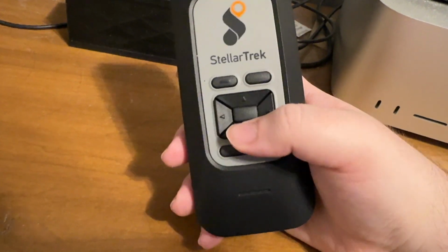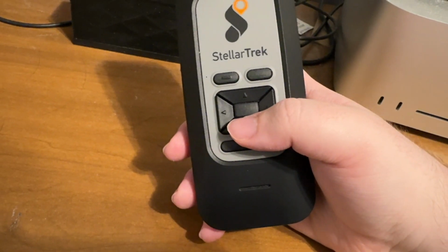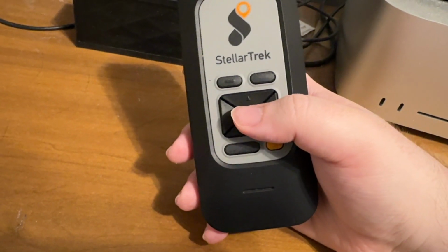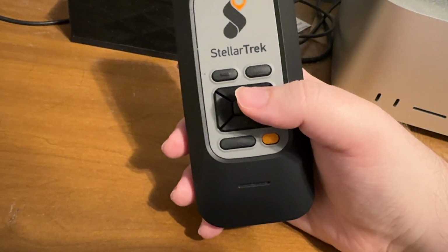So if we down arrow now, Start in motorized mode. Enter map browse. Delete landmark. Rename landmark. Rename landmark with text. There's rename with text. Rename the selected landmark. Let's press confirm. Enter landmark's name.